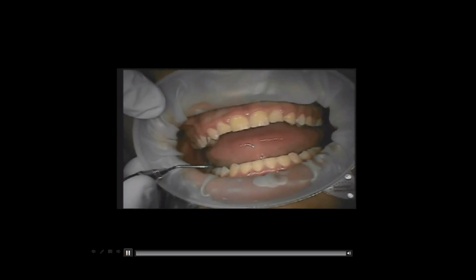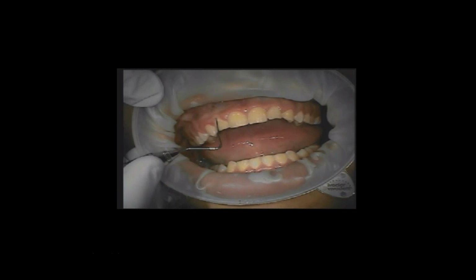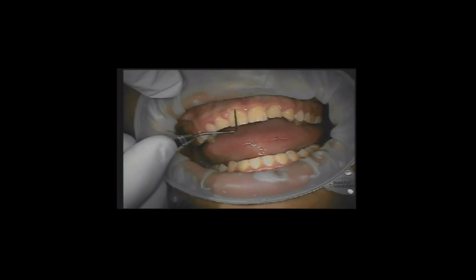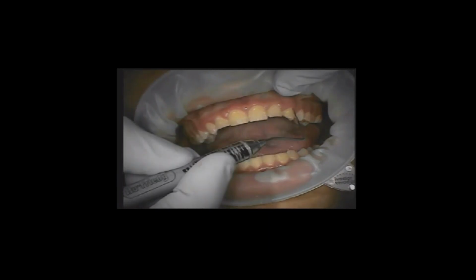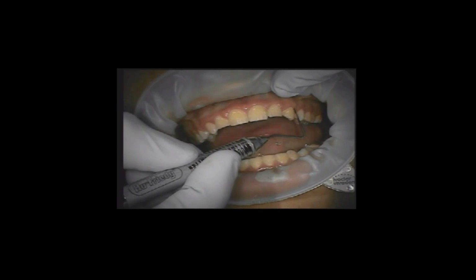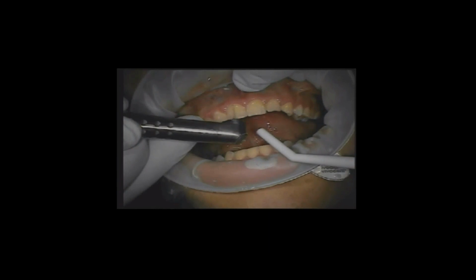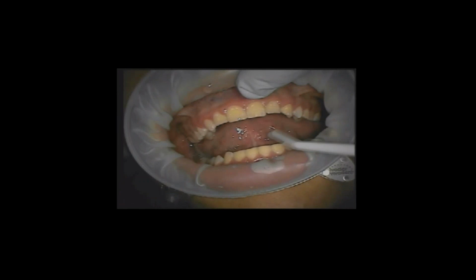And again, everything's lined up. This patient came in and had short teeth to begin with, so these are good patients to inform the patient or the parent that when we're done, we're going to line all the teeth up, but we're not going to make the teeth look longer by doing orthodontics. The way we do that is at the end. Usually I wait about 3 to 4 weeks after the brackets are off and then have the patient come back, and then we can start to idealize the shapes of the teeth better.